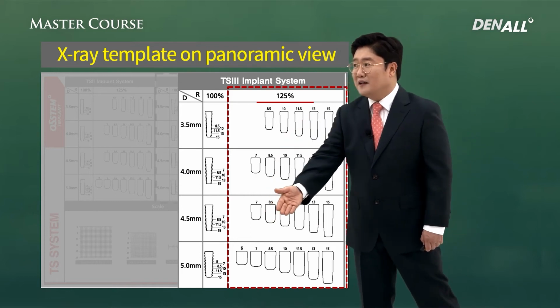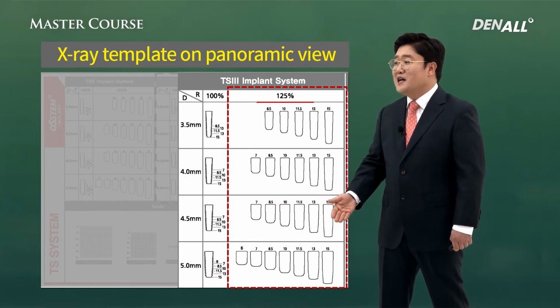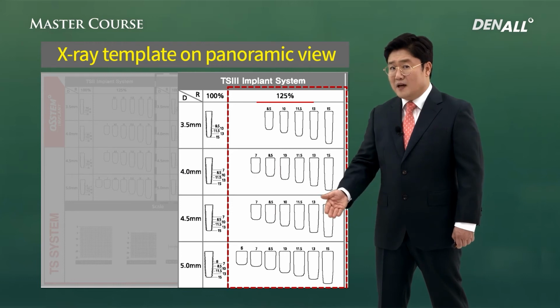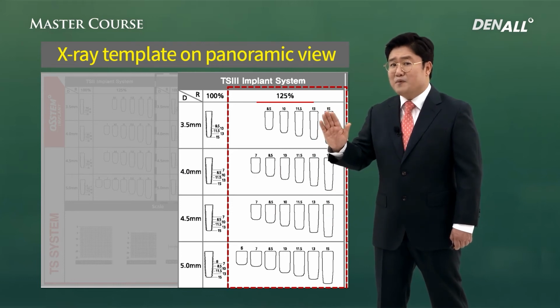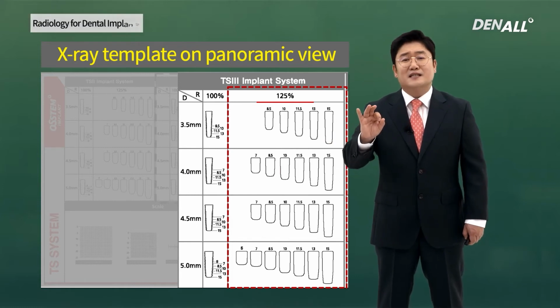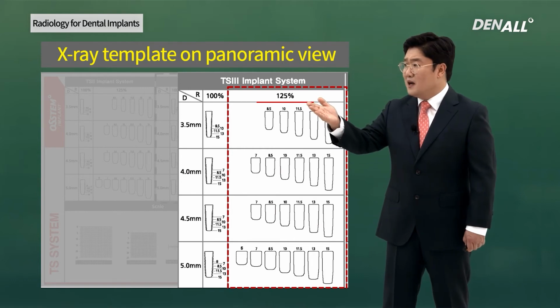For another example, 4.5 diameter, 10 millimeter long implant looks like this. The fixtures shown on the X-ray template are not the actual sizes.